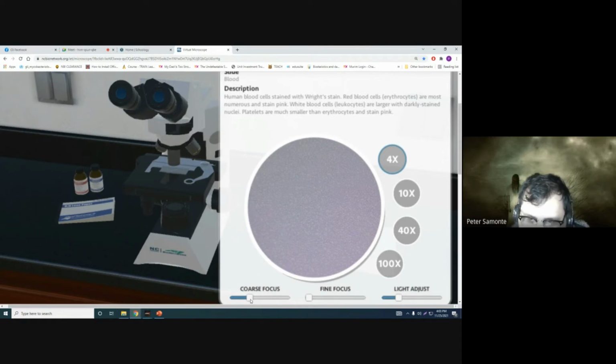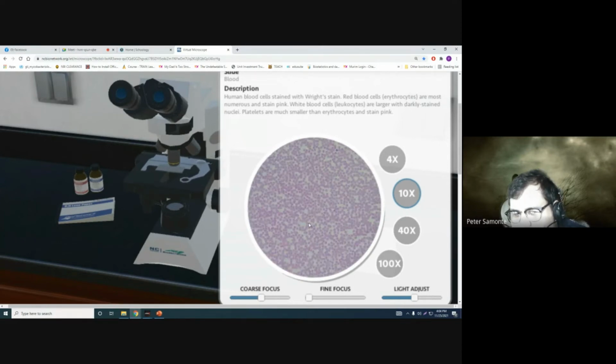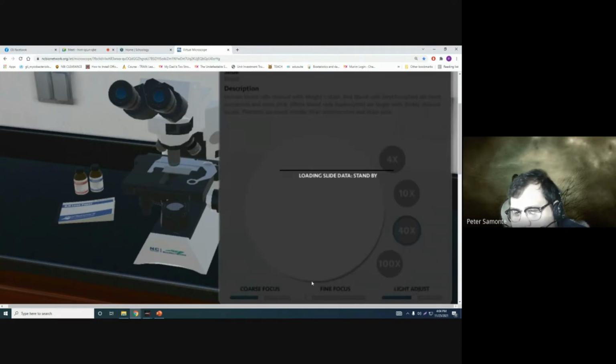Until you view this. That was my light. Once you've seen something, you now proceed to your LPO. It's a bit dark, class. Adjust the light, then try to make it as visible as possible. Then you now move to your HPO. Now, your HPO, class.